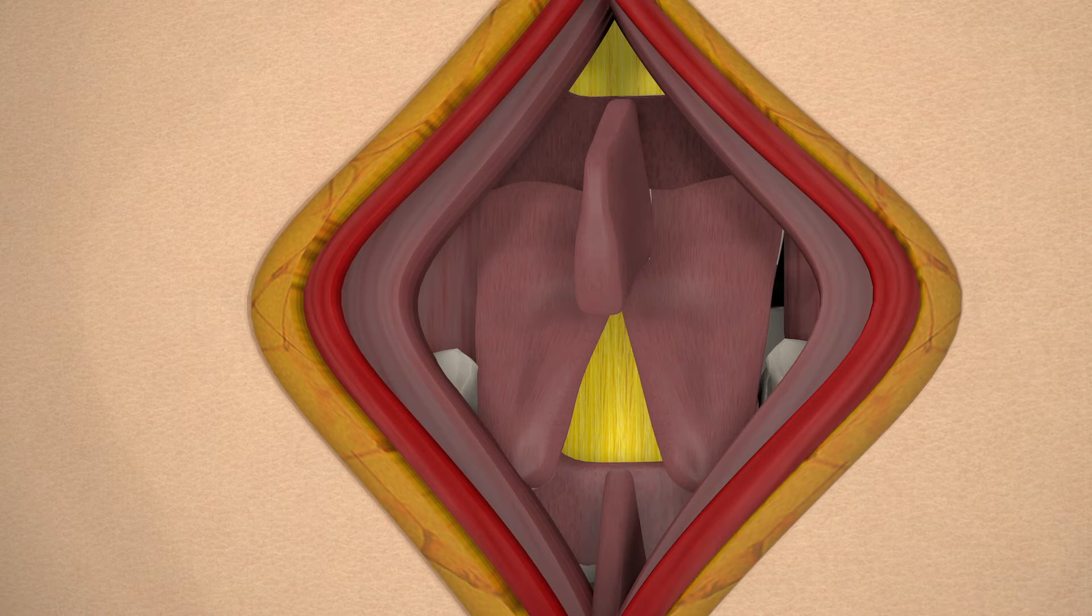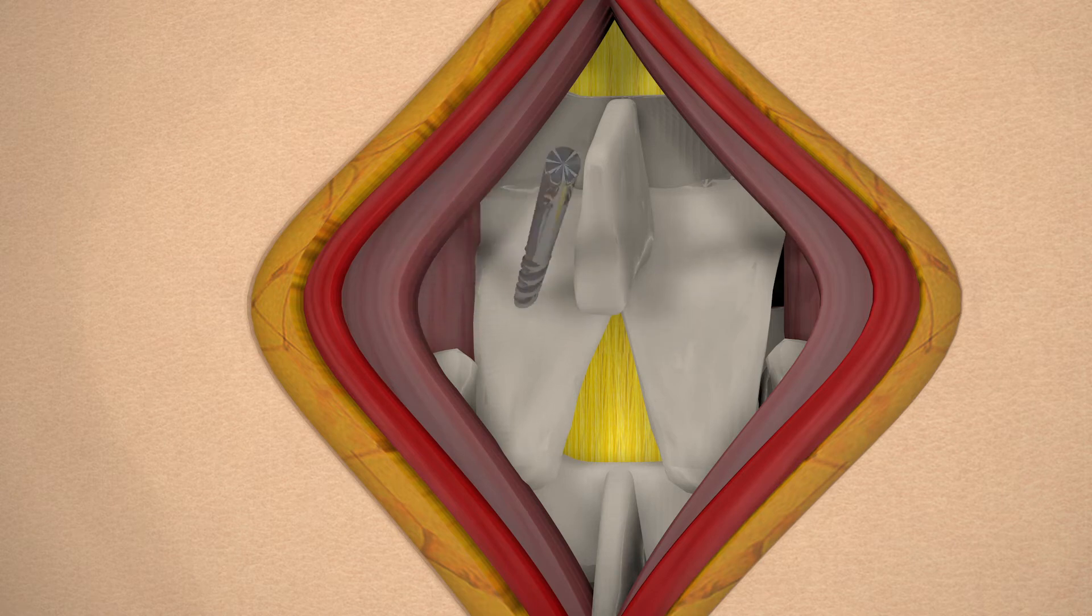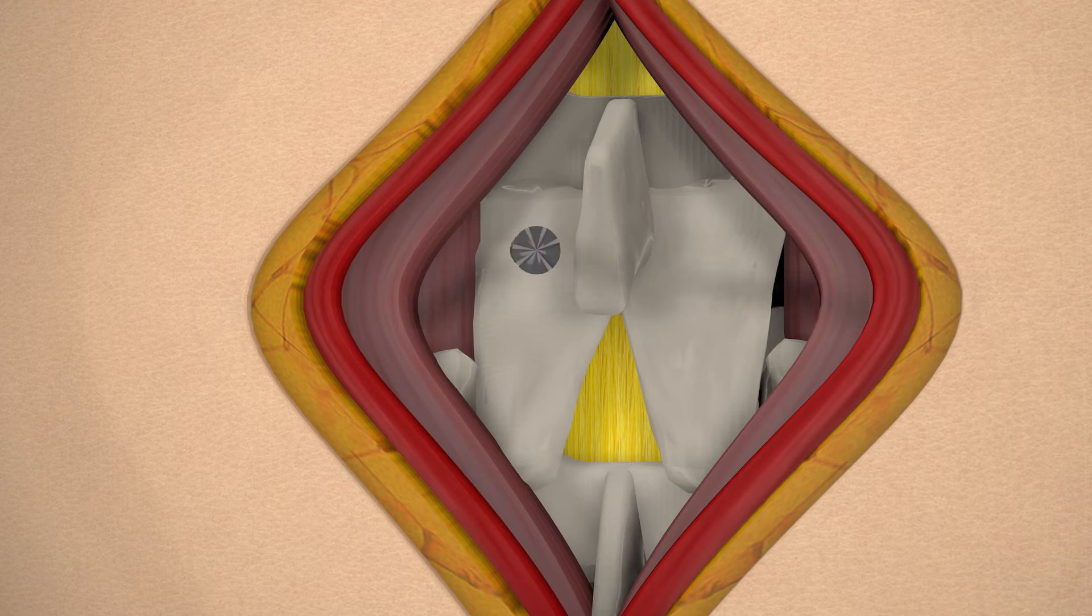After the excess tissue has been removed around the body of the vertebrae, a high-speed burr will be used to cut a window into the lamina. This is called the laminectomy and allows the surgeon to gain access to the spinal canal.